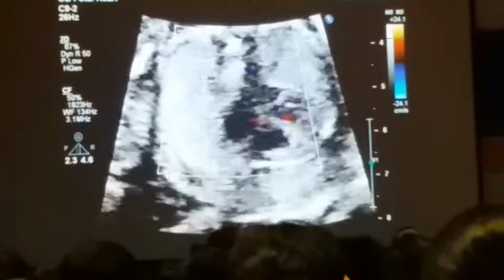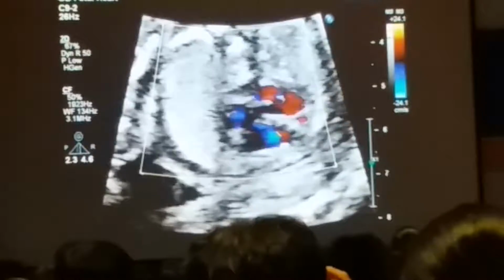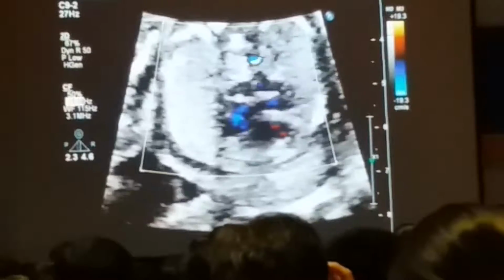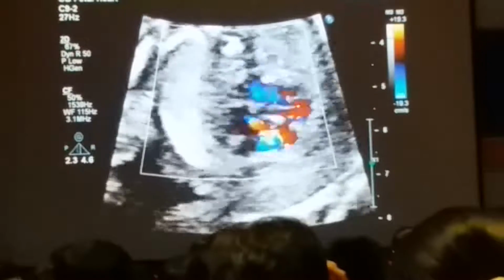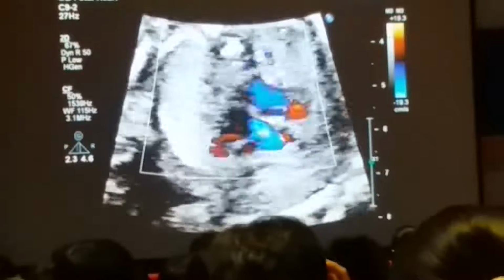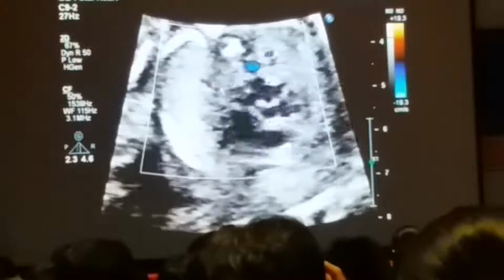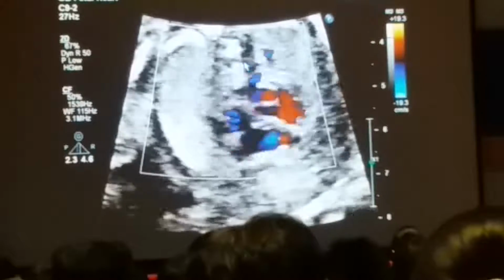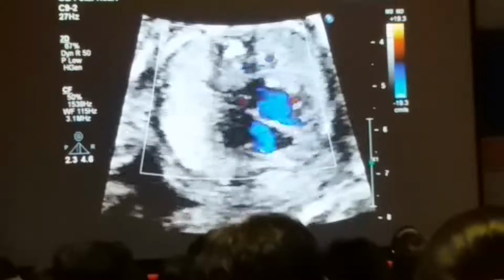Okay, so what we need to make a little comment about is scale. There's the flow, where's the pointer here? Pointer's here. I'm looking at the flow in the pulmonary veins and the pulmonary artery here. There's the descending aorta. This is the pulmonary vein and pulmonary artery.